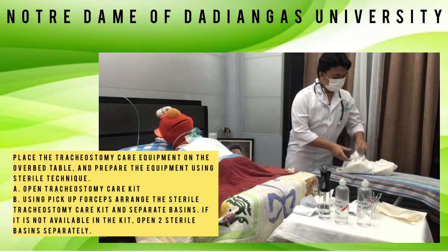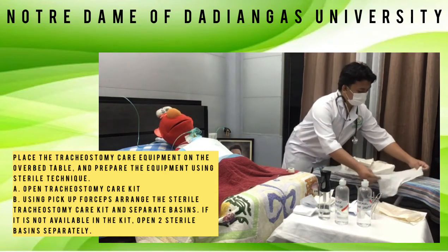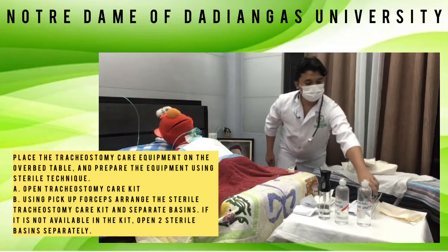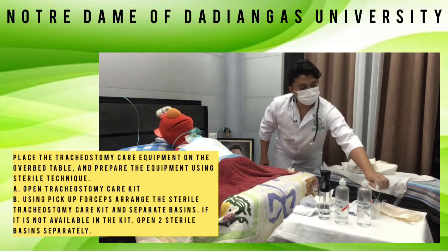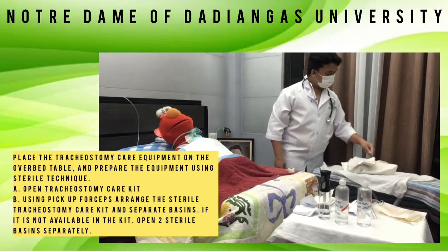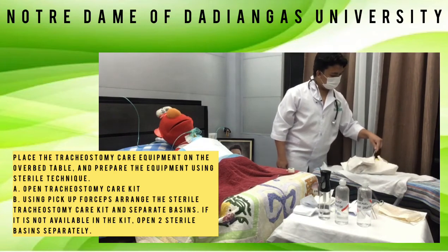Place the tracheostomy care equipment on the overbed table and prepare the equipment using sterile technique. Open the tracheostomy care kit using pickup forceps. Arrange the sterile tracheostomy care kit and separate basins. If it is not available in the kit, open two sterile basins separately.